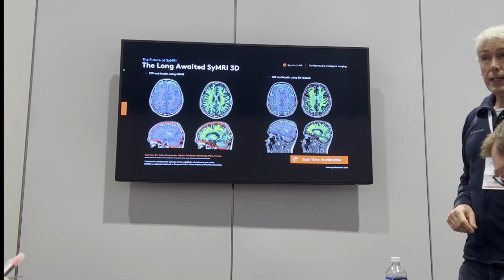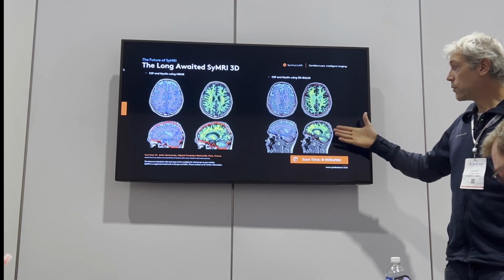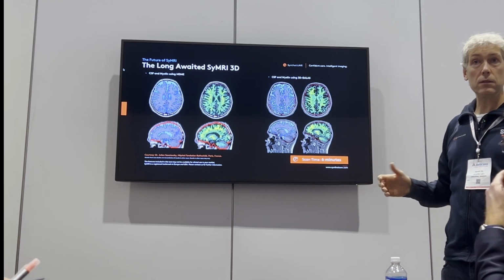Because that was all the synthetic imaging, so you can recreate the T1s, T2s, and anything you want. And on top of it, you can also recreate CSF, the intracranial volume, as you see here in the red line, the myelin maps, everything. All in 3D.